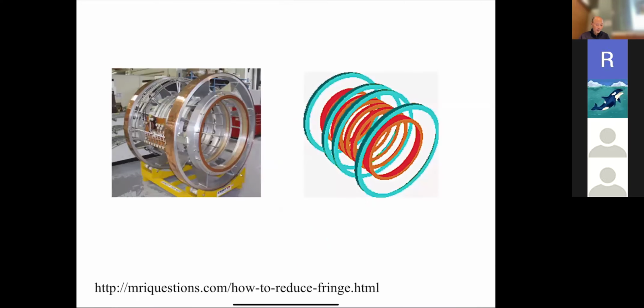Okay, so the other thing we need to talk about with magnets is, we've talked about the main coil, which creates a magnetic field. But especially if you want to put a magnet in a room, you don't want these fields to go too far. Because say we put a magnet here and someone's walking through the hallway. Once again, they're walking through a magnetic field, right? And as they're walking through the magnetic field, they're causing electric currents in their body. Especially people with pacemakers, especially older design pacemakers, or any medical device which you're causing interference in could be a problem.